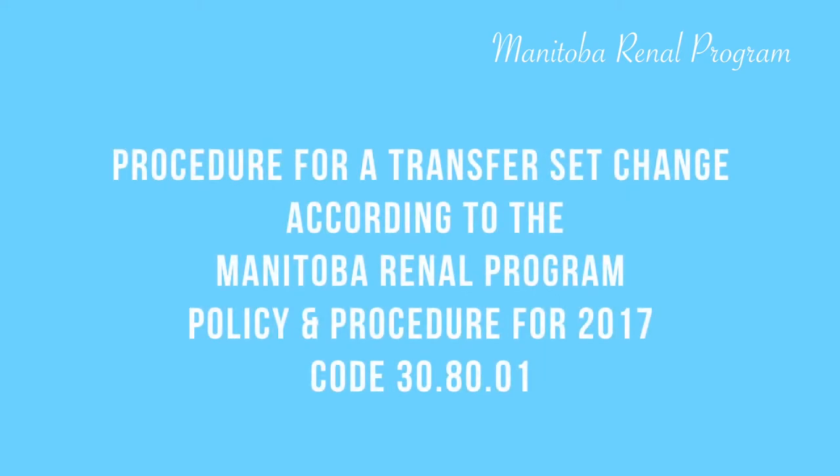This video will show you how to carry out a procedure for a transfer set change according to the Manitoba Renal Program Policy and Procedure using the guidelines for 2017.